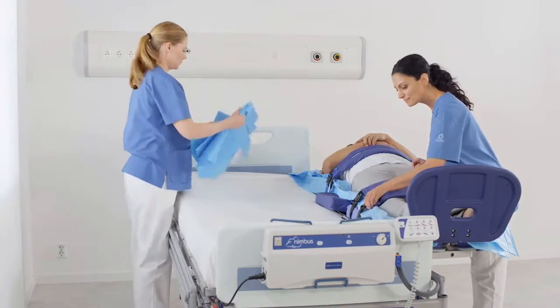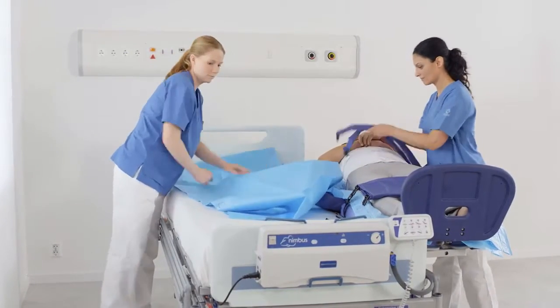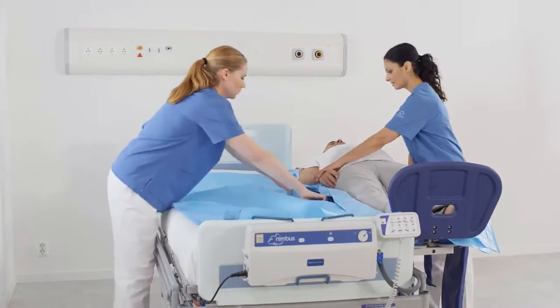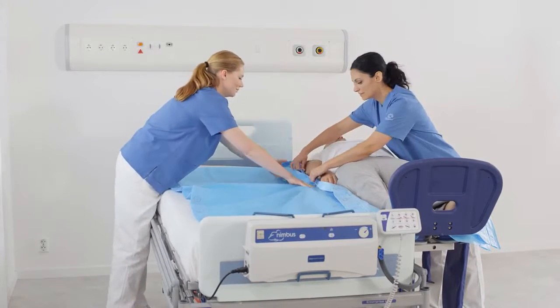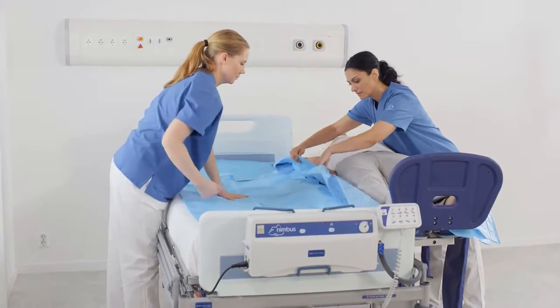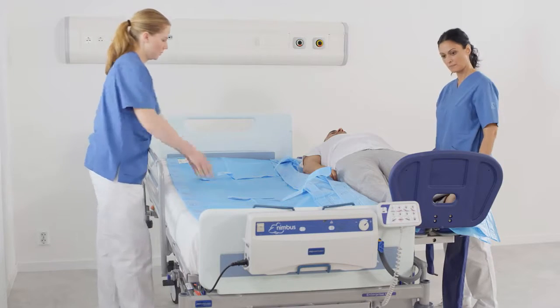Detach all safety belts on the bedside and fold them away. Place a sliding sheet on the bed. Make sure that the edge of the sliding sheet under the patient overlaps the edge of the sliding sheet on the bed. Attach extension straps if available. Fold up the bed rail on the non-transfer side of the bed.